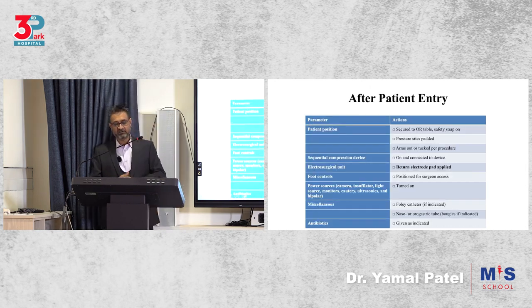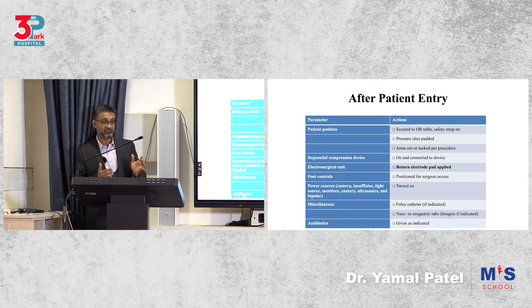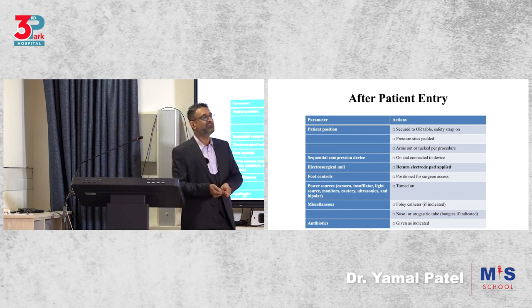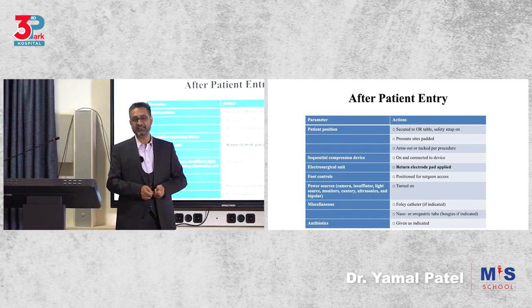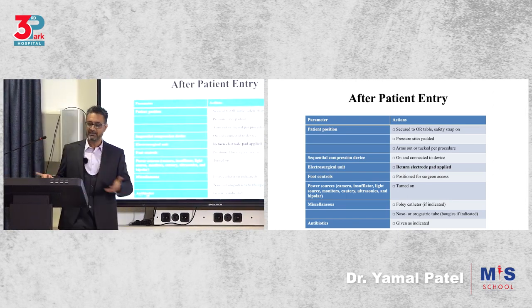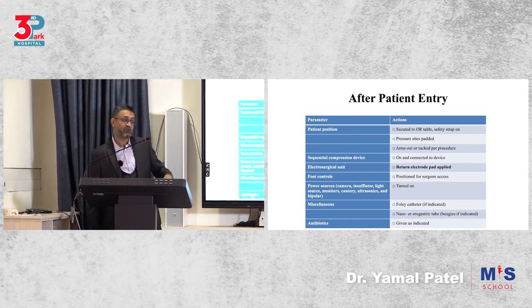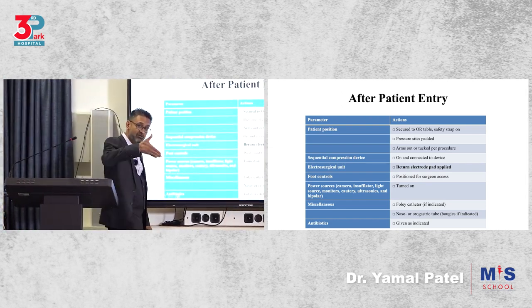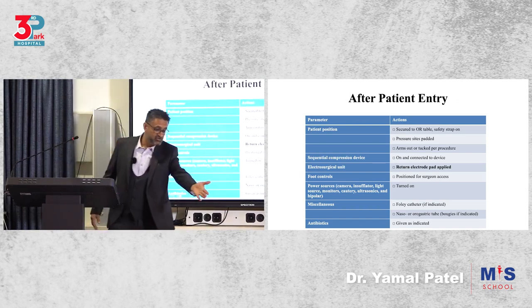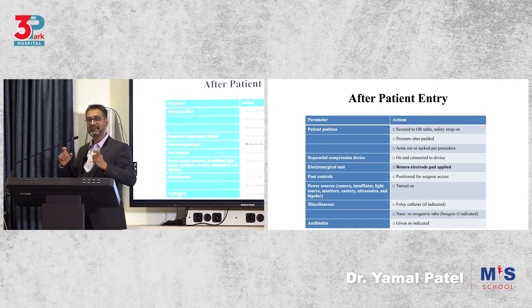After the patient is already put in, the first one, is the patient secured to the table? So this is your team doing it while you're operating so that you're not going to be making noise every now and again. Why is this not done? Why is that not done? Because they are not aware. So that's situational awareness. Is my return plate correctly placed? Remember I said not at an angle, straight, widest across? Is it connected? Is that showing a green, not a red, that there is disconnection? All that should be checked and set.